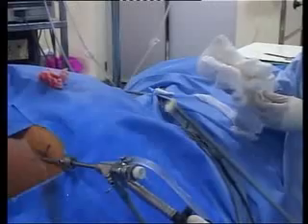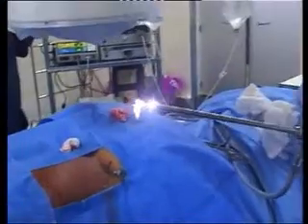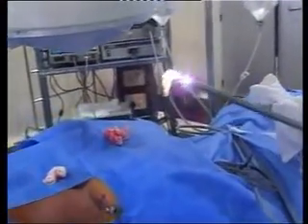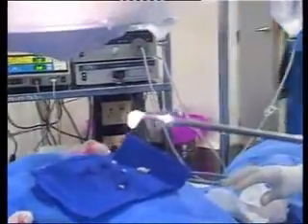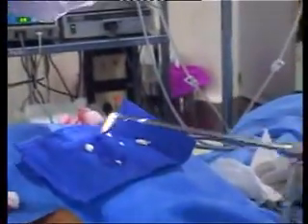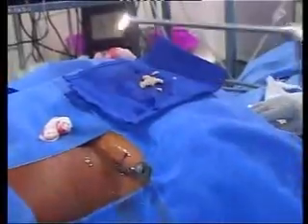The fragment is removed with gentle rotatory movement of the grasper, clearing the axilla. Multiple fragments are removed from the patient and all are weighed. The average nucleus weighs about 8 grams, and in this patient the removed fragments totaled close to 4 grams. A total of 4 fragments were removed, achieving complete decompression of the axilla of the nerve root, with clear demonstration of the cleaned, decompressed axilla at the end of surgery.